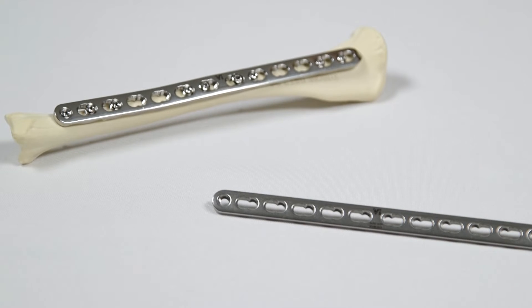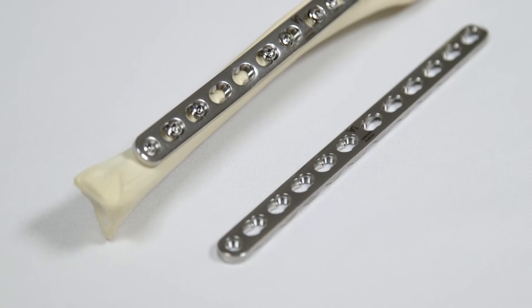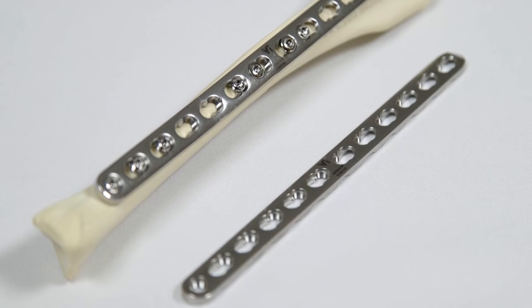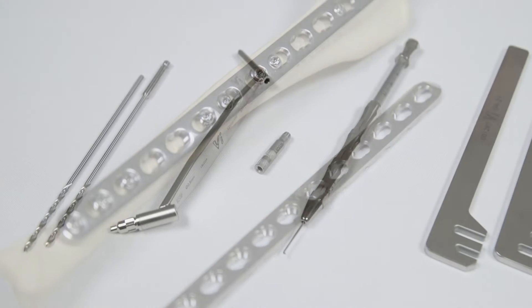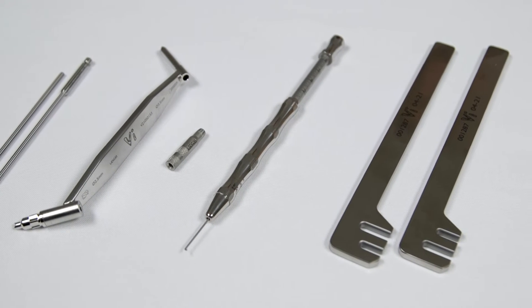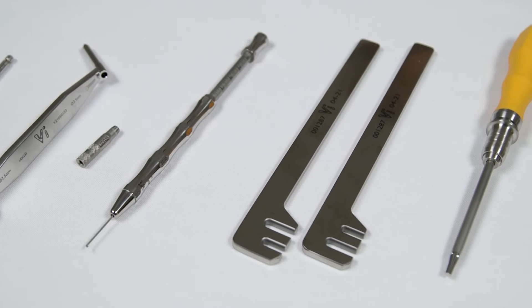For a transverse fracture, axial compression is appropriate and desirable. The DLP can be used in non-locking mode to achieve this, with the benefit of the stability and strength of the locking mechanism for the non-compression screws. Specific equipment is required for using a DLP in this way, and all equipment must be appropriate for the size of implants being used.